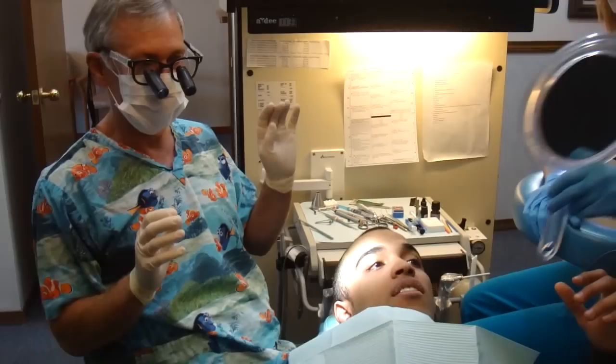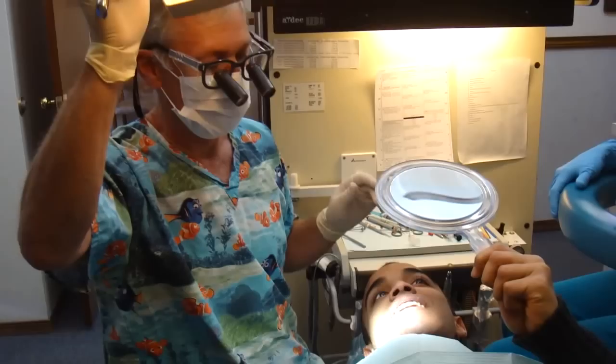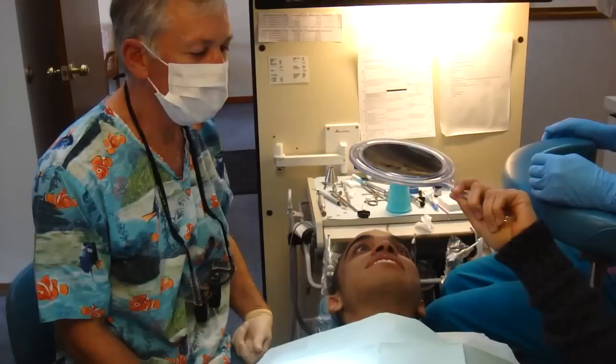You like them? Mm-hmm. All right. So what we do is we're going to rinse those off, and then we're going to bond them in, and they'll never come out. There they are. This looks perfect. You like them? Yeah. We managed to close that space without making those two front teeth look too big, I think. I like it. You okay with it? Yeah.